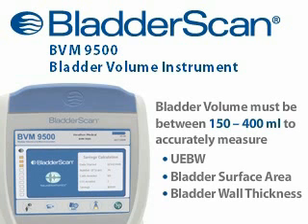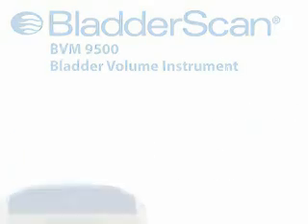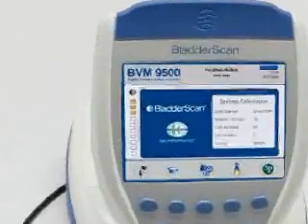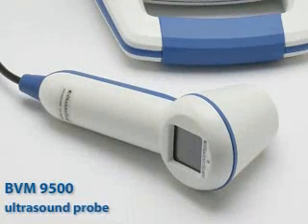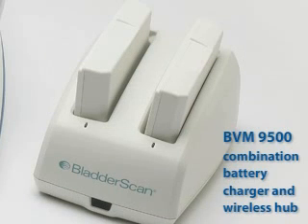Within this range, UEBW, bladder surface area, and bladder wall thickness will automatically be calculated. The BVM9500 also provides the option to manually measure bladder wall thickness when bladder volume is between 150 and 400 milliliters. The BVM9500 consists of a battery-operated color display console, a handheld ultrasound probe that scans the patient's bladder, and a combination battery charger and wireless hub.